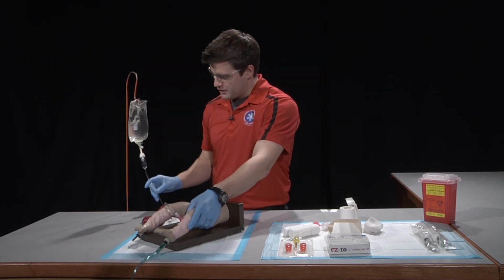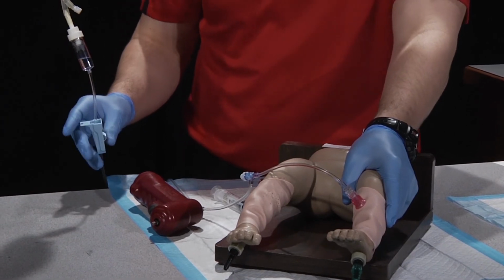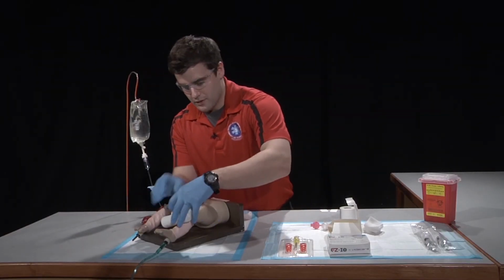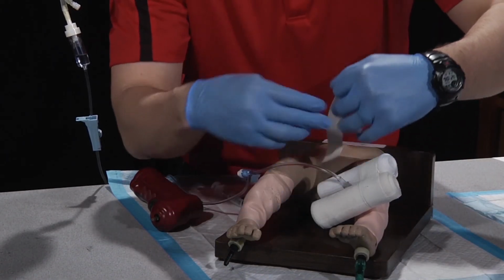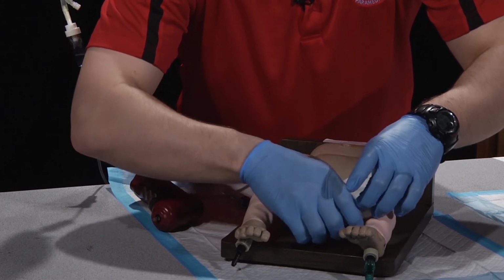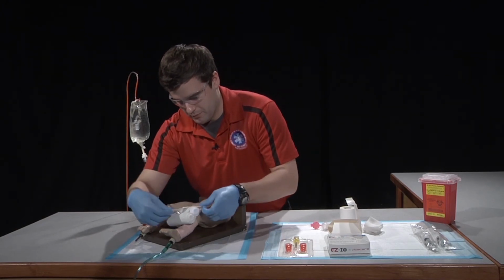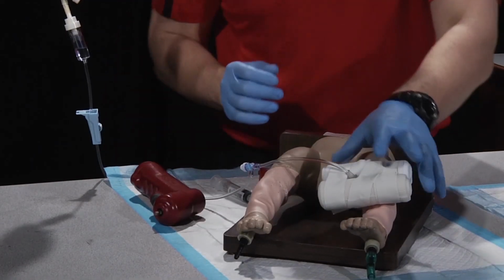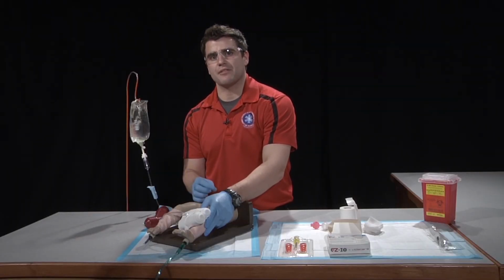From there, we will adjust the flow rate appropriately and stabilize the line. After securing the device, we will assess our patient for our therapeutic response as well as any adverse reactions.